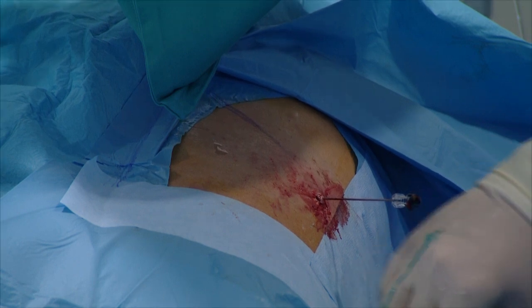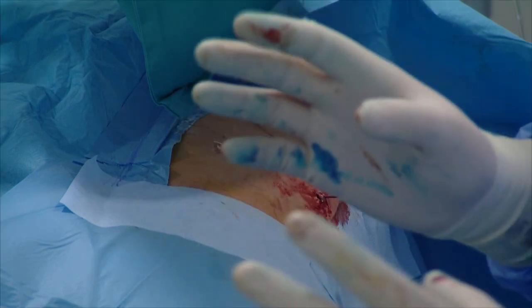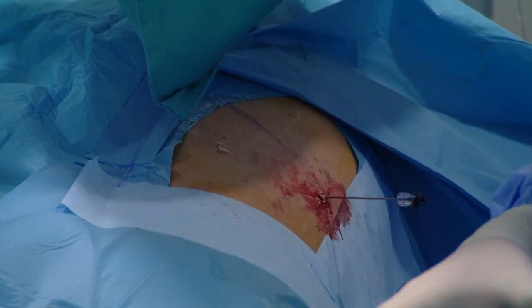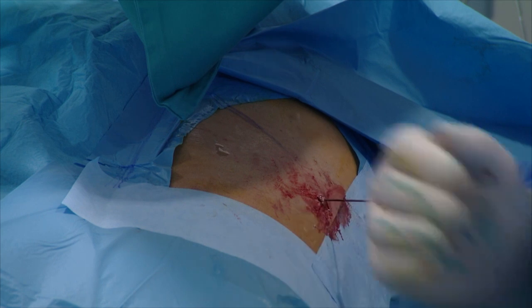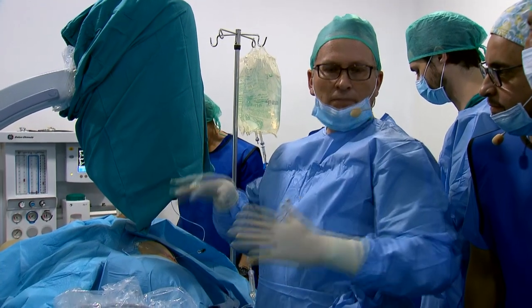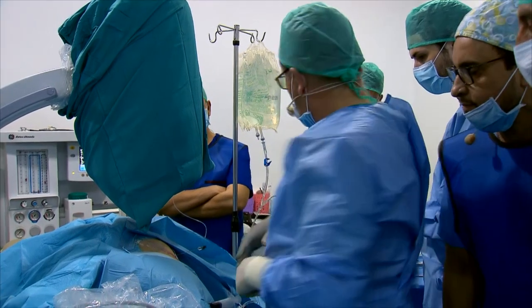Okay. Now we need the guide wire. It was clear in the fluoroscopy view. The idea is to determine the depth of the puncture by ultrasound. This is our third dimension. This is the main difference between the bull's-eye technique and the ultrasound-guided puncture. We don't have to move the C-arm. The patient is like this, and that's all. Okay, it's very good.